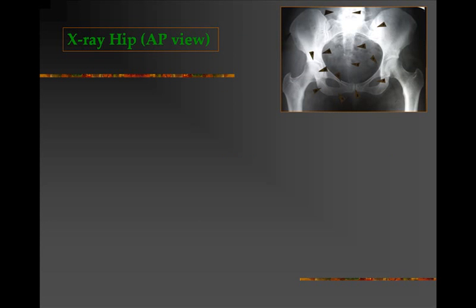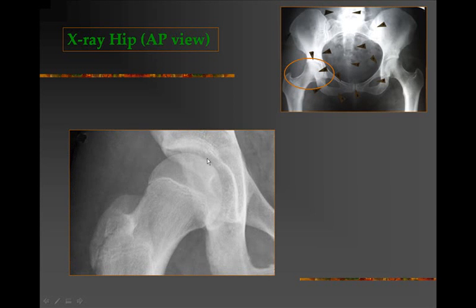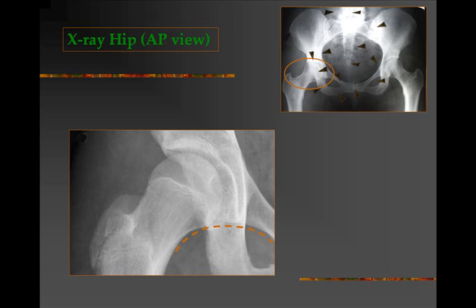Let us start with an x-ray of the hip joint. Here we see a normal AP view or anteroposterior view of the pelvis. Focusing on the right hip joint, we see the acetabulum, the spherical head of the femur, the neck of the femur, the greater trochanter, and then down below the trochanteric region extending into the shaft. We observe a continuous smooth curved line extending from the inferior border of the superior pubic ramus up to the neck of the femur.